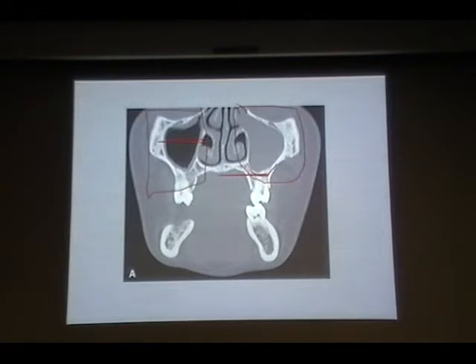So here, you can see this is part of the bone. You can see the density is different compared to this one. We know that here there are lots of muscles, so we can compare this density with this one. It's similar, so you can say there is some kind of soft tissue. It's not bone, because if you see a structure like this, then we can say it's bony growth.